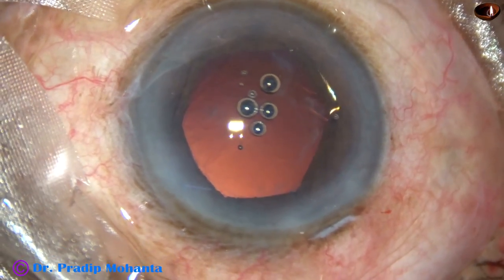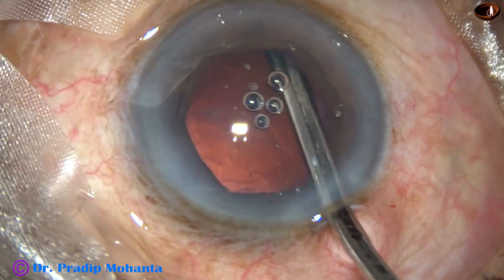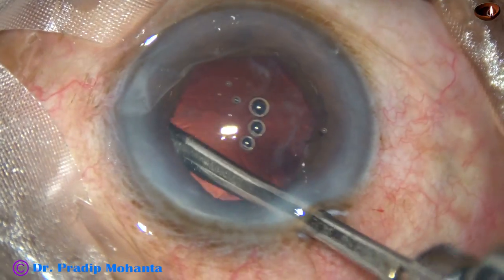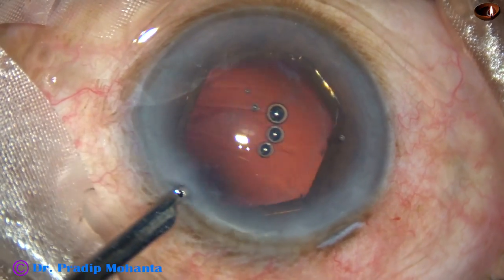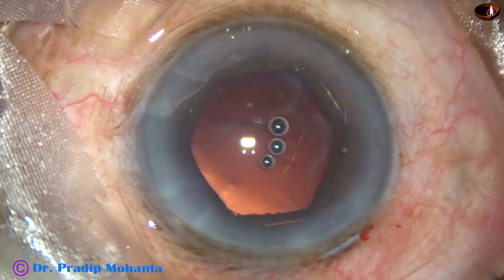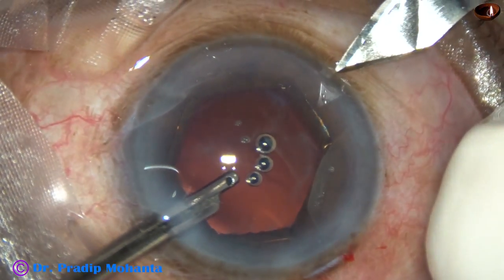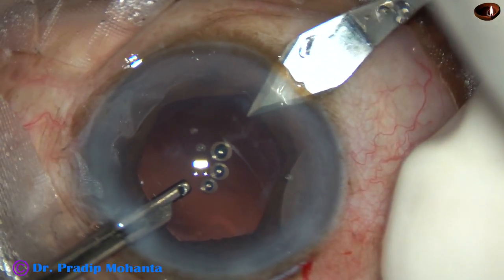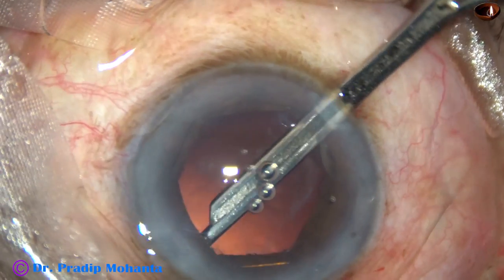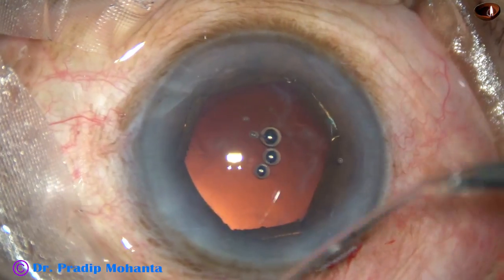Now, cortical cleanup. Viscoelastic has been injected. I am using a 23-gauge Simcoe cannula — a very thin cannula — for removal of the cortex. I don't find any cortex from 2 o'clock to 6 o'clock. Going through the left side port, I find a lot of cortex at 10 o'clock and 9 o'clock. There is also sub-incisional cortex, so I make an additional side port at 7 o'clock to remove it. A big piece of cortex was there, and now cortical cleanup is done very nicely.